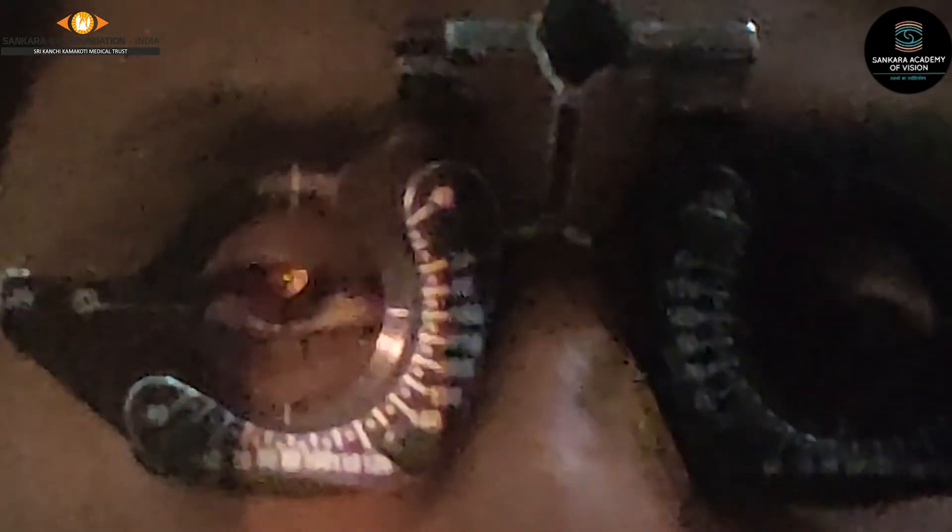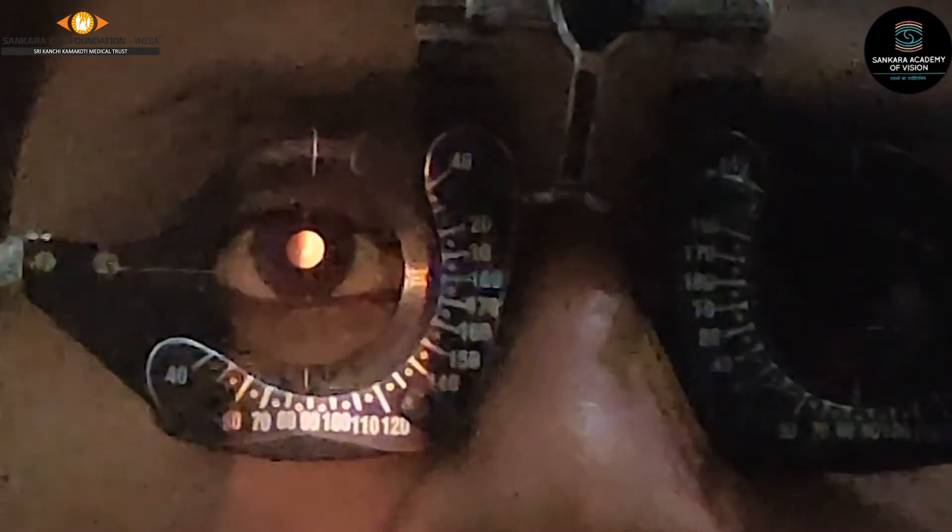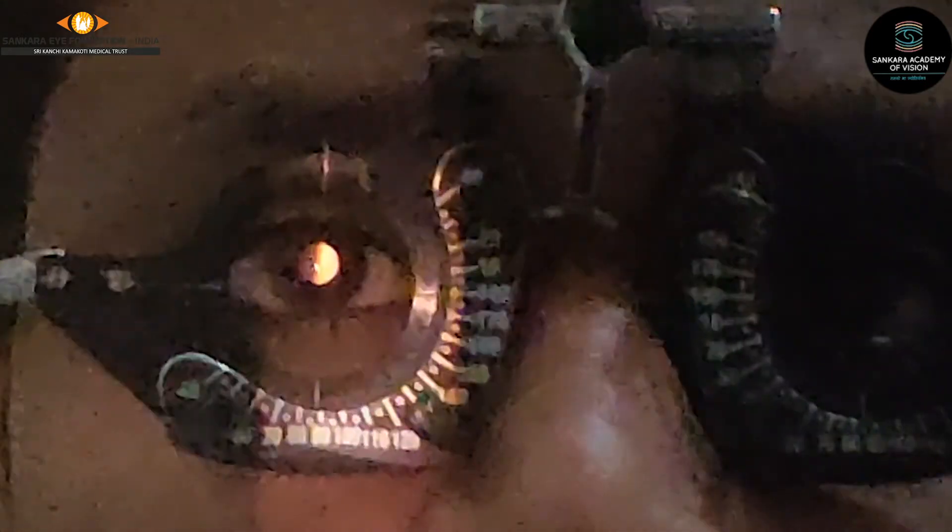In this demonstration, a streak retinoscope is used and the light reflex is visible on the pupil. The streak is held vertically to examine the horizontal meridian, and a with movement is observed. With movement is neutralized using a plus lens. The examiner starts with plus 1.25 diopters — moving the sleeve still shows a with movement, so the plus power must be increased to reach the neutral point.